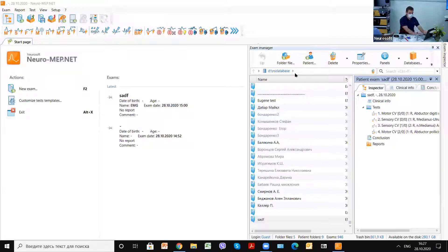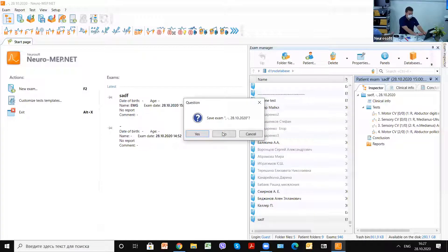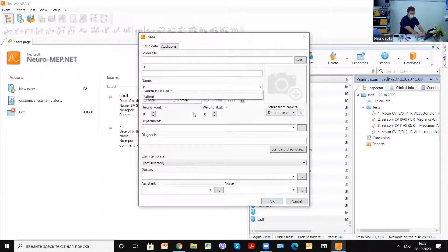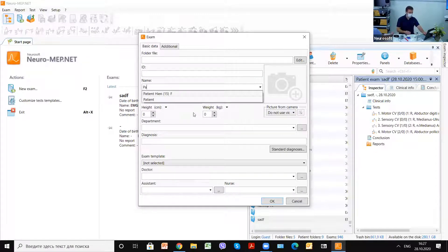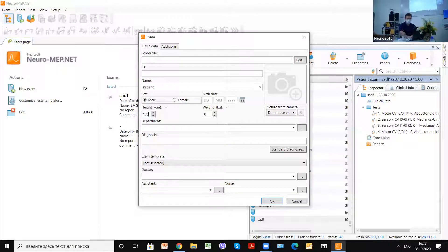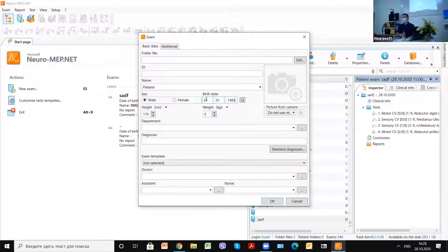We will choose a new exam. It's better to input at least basic patient data — for example, sex, height about 130 — and the birth date, because some normal values are connected to these parameters.